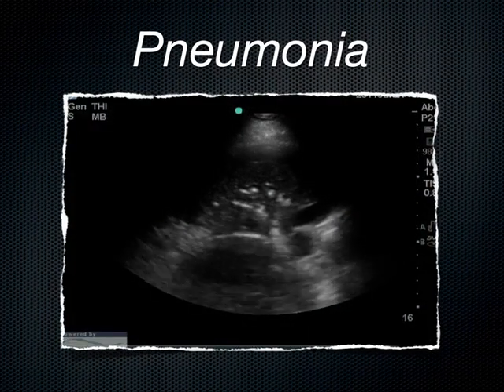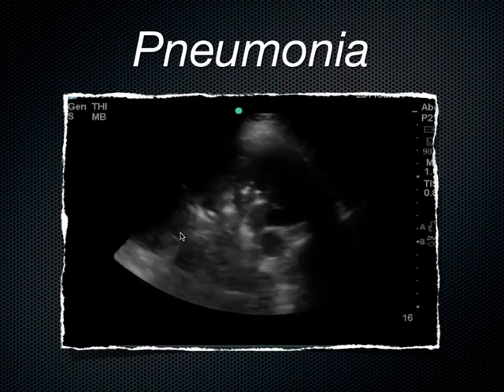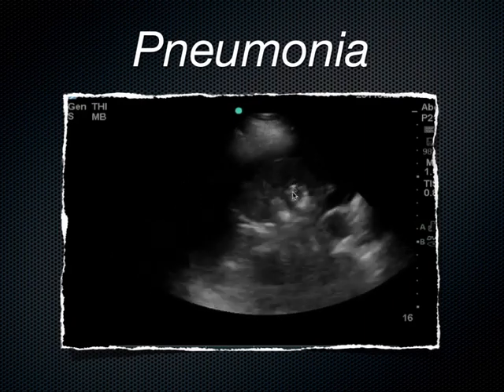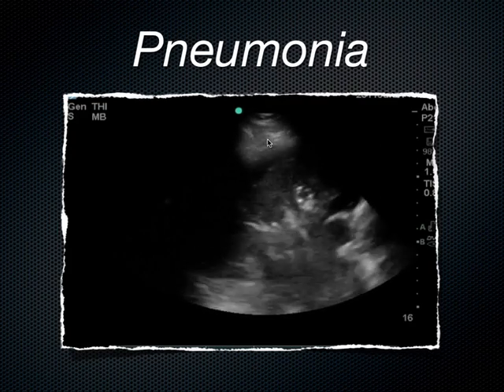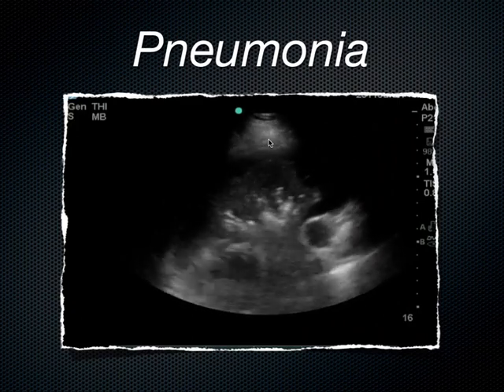This is a patient that had pneumonia recently in the hospital. I was doing rounds with the third-year medical students maybe a month ago, and we came across a patient with pneumonia, and I actually scanned the patient from their entire posterior of the back. The guy was sitting up, and so I didn't want to disturb him too much and have him lay flat and look at his coronal views or lateral views.